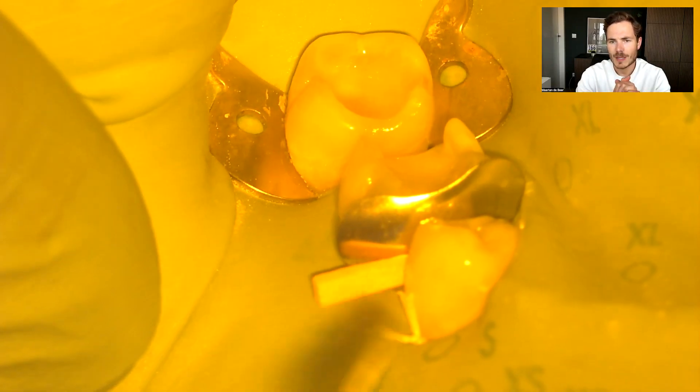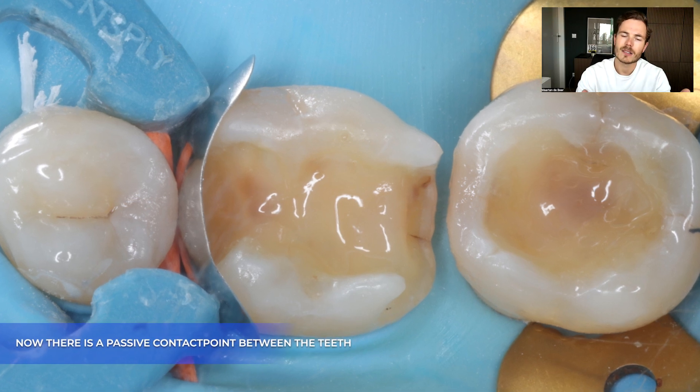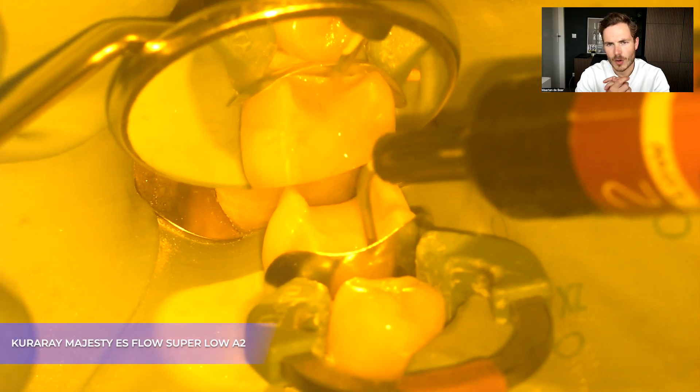Now I refit my matrix band and we can see that we have a way better contact point. I place my wedge to make sure that it's really nicely sealed at the cervical. We've placed our ring, and when we look from the occlusal we can see that we have a contact point. Now I can continue with restoring the mesial side of the first molar.